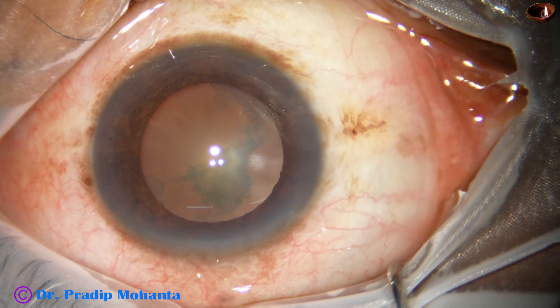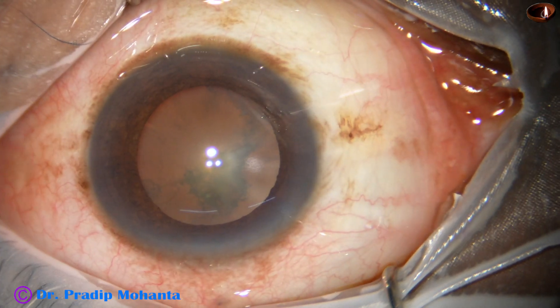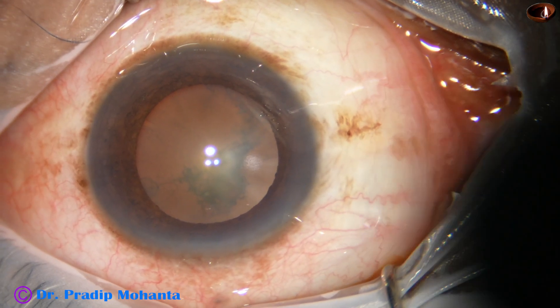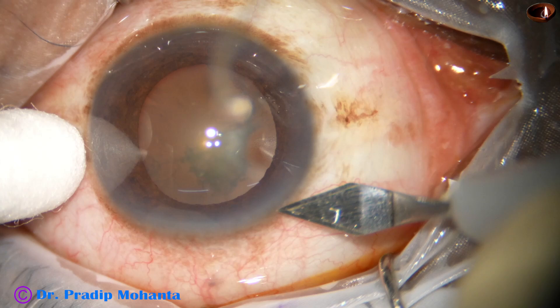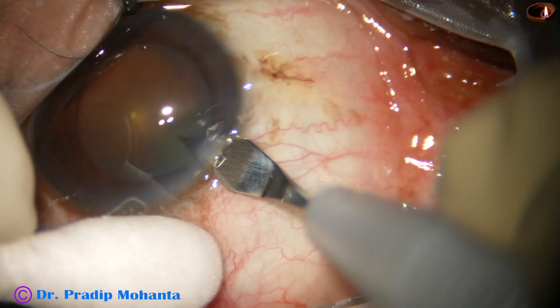The ocular surface has been thoroughly irrigated applying few drops of povidone iodine. Now I take a 2.8 millimeter steel keratome and here goes the main incision at mid-limbus.